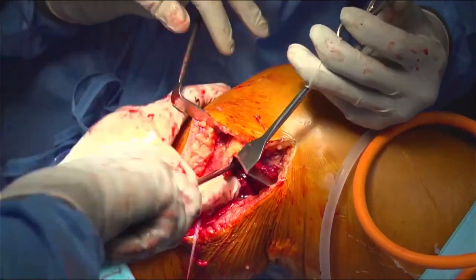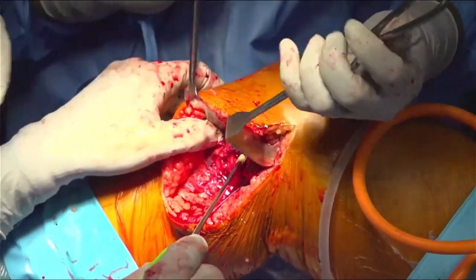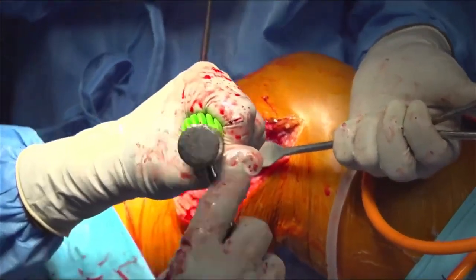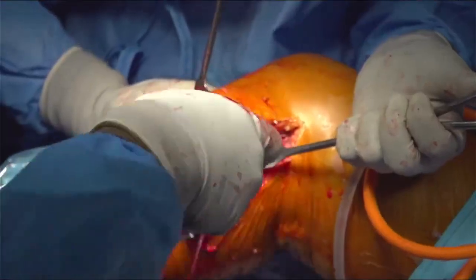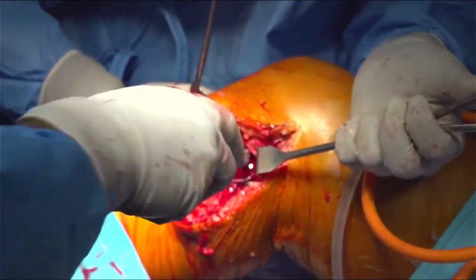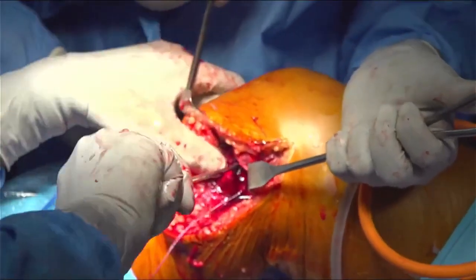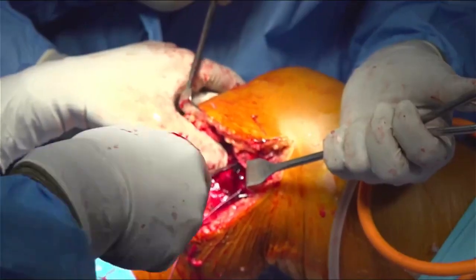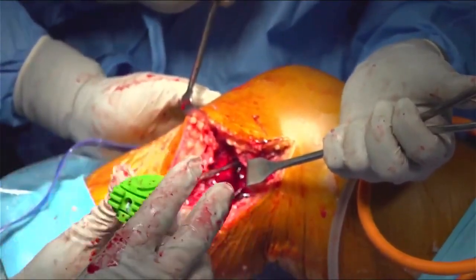So these are unloaded anchors. They don't have needles, non-needle suture anchors.